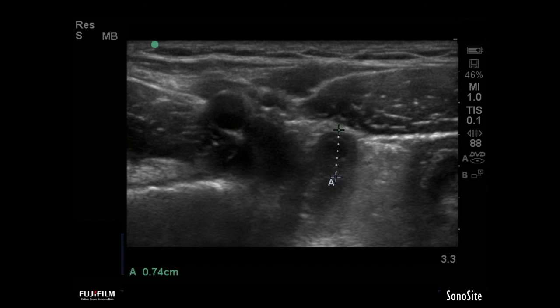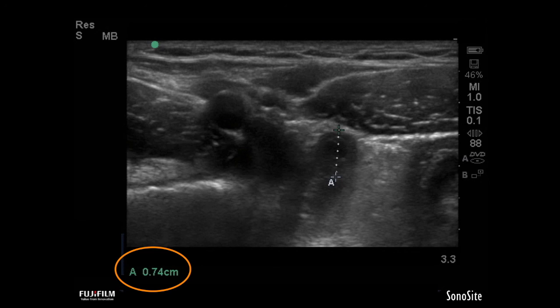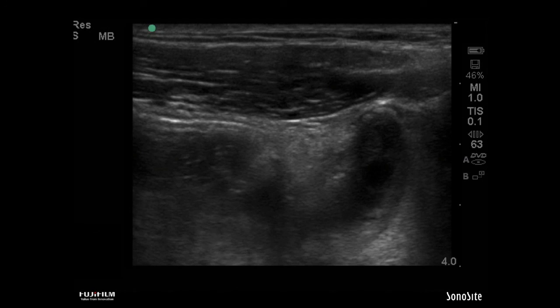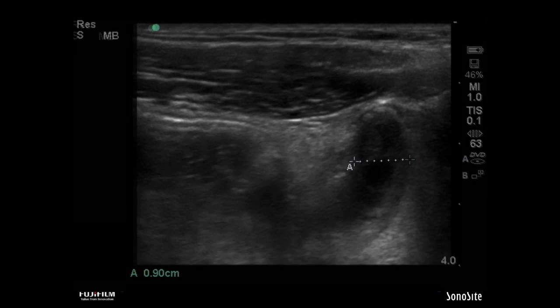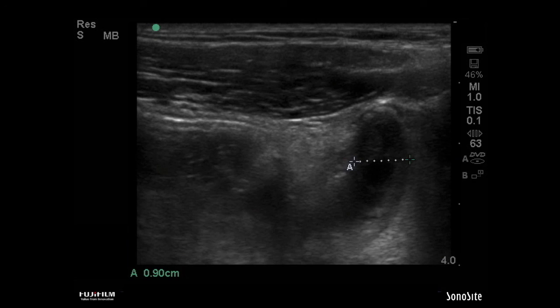I then start to rotate to get a better view. This really highlights the idea of tip appendicitis — we have to follow that tubular structure all the way to its end to say for sure we don't have swelling at that end. Someone may have just dilatation at the very distal piece, whereas the midpoint of the appendix may appear normal size. We wouldn't want to call someone who has right lower quadrant abdominal pain with a normal-appearing midpoint normal if we haven't fully visualized the entire length of the appendix.